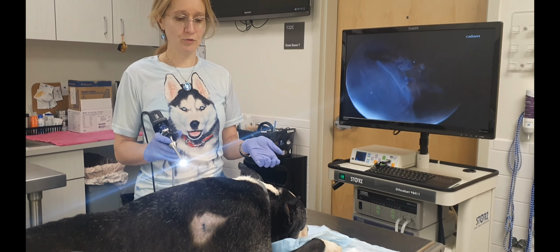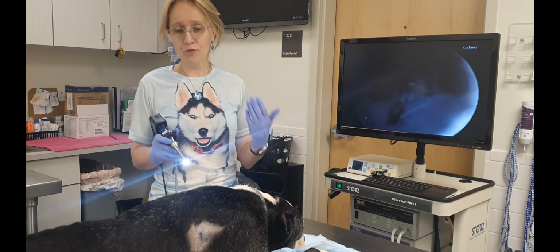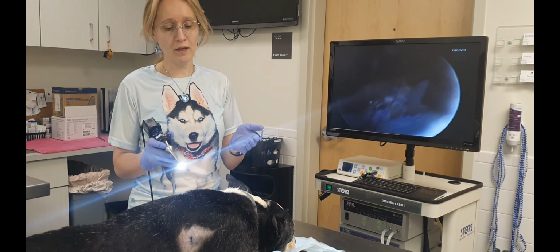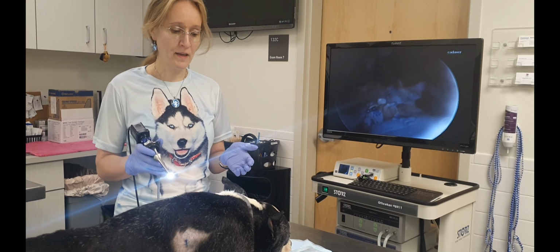I honestly try to do videootoscopy always on both ears, starting with a healthy one, but if you're expecting to do only one ear, you may not need this position. If you expect to do both, that might be helpful, especially if the time under anesthesia is critical.